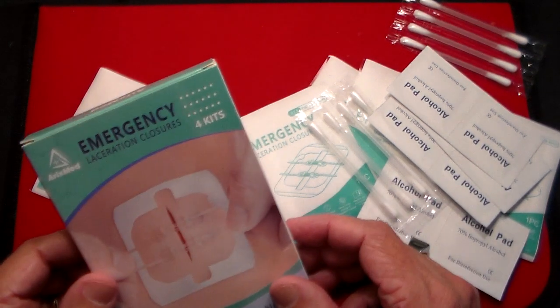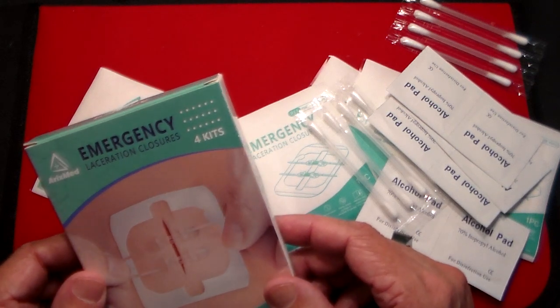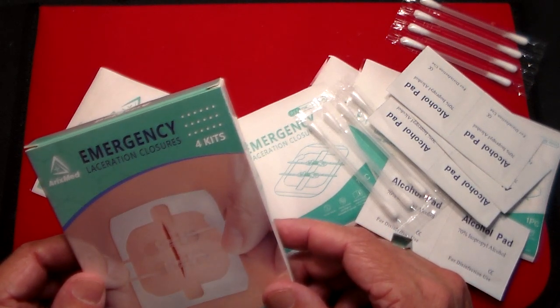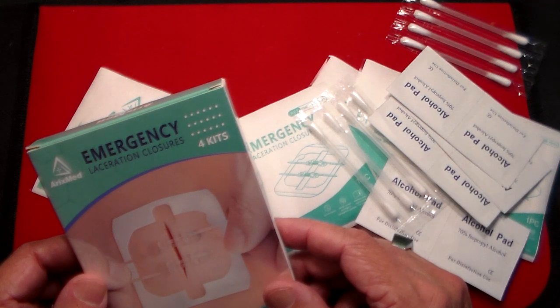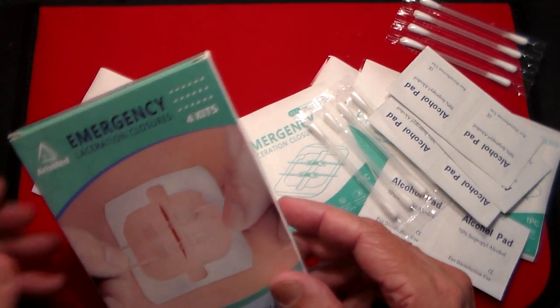Collector 007 here with something a little bit different for the channel, but that's what I've been trying to do lately, mix things up a little bit. This is a product by a company called Arexmed, and it's an Emergency Laceration Closure Kit.